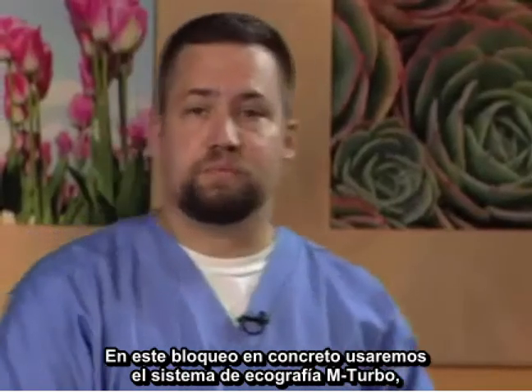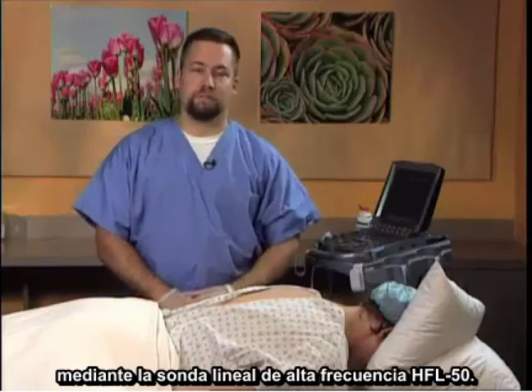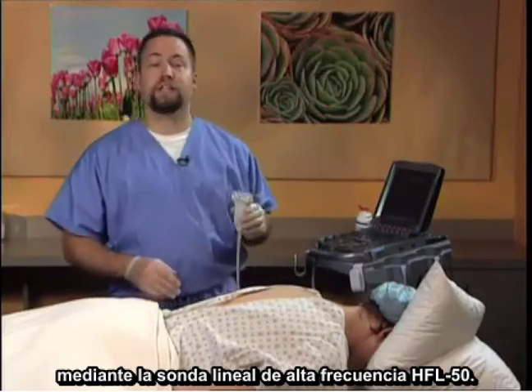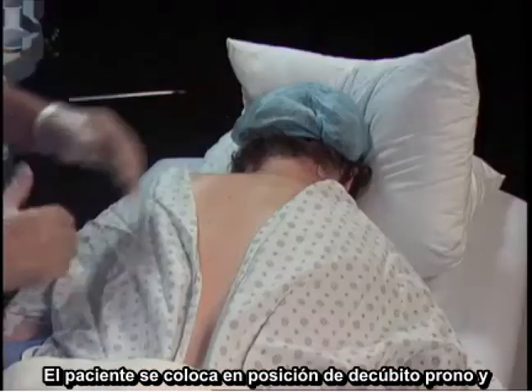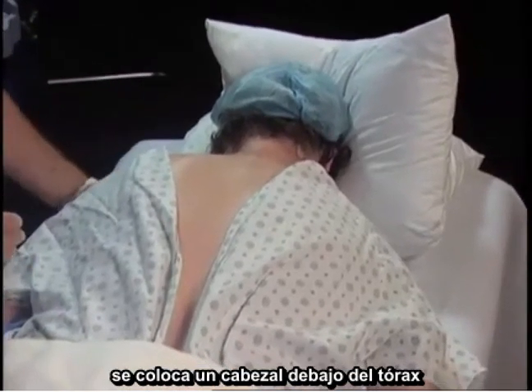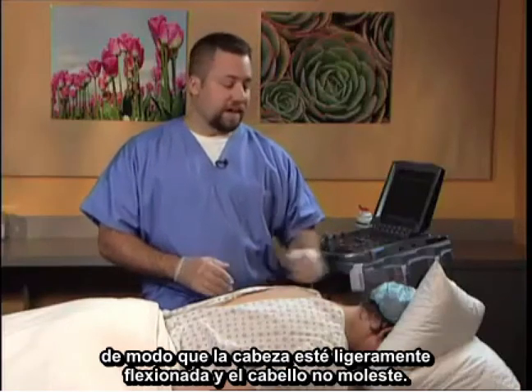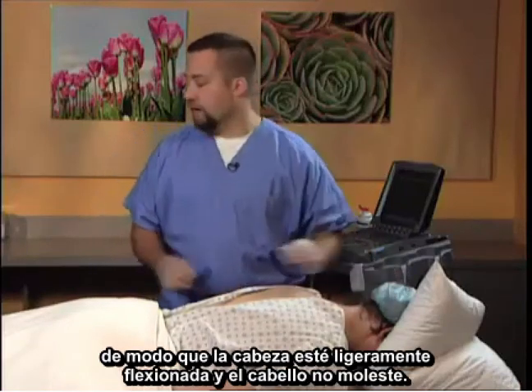Utilized in this particular block will be the mTurbo ultrasound system utilizing the high frequency HFL-50 linear probe. The patient is placed in the prone position, a bolster is placed under the thorax, the head is slightly flexed, and then the hair moved out of the way.